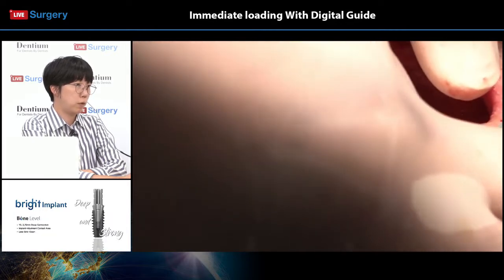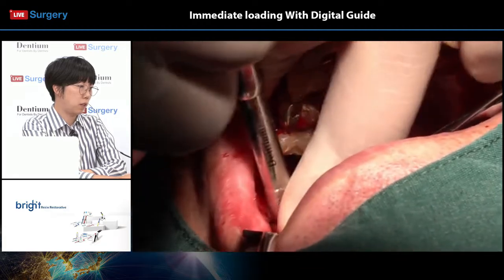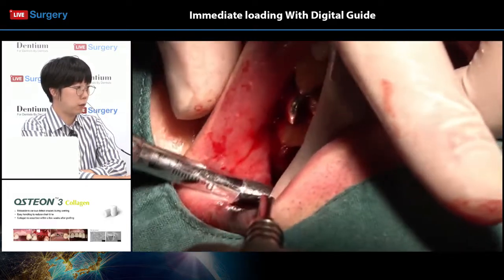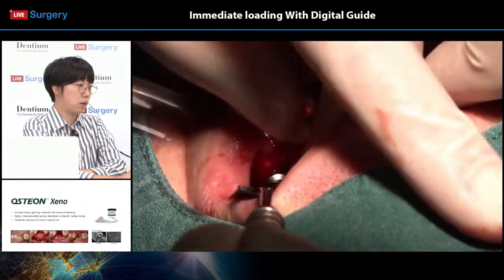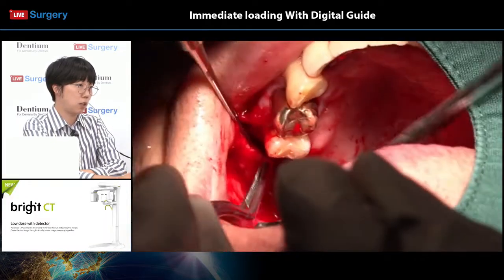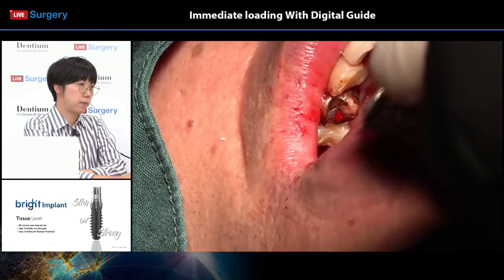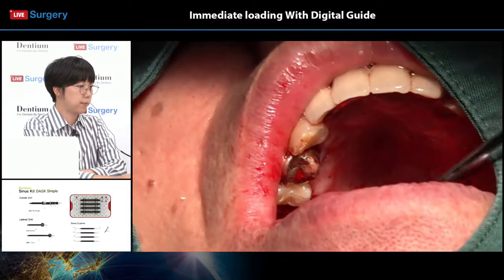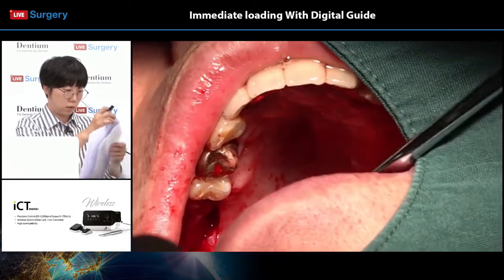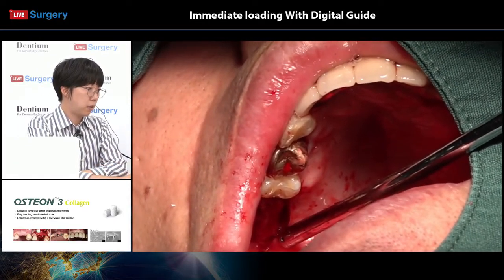Oh, and as I've mentioned before, since Dr. Lee wants to preserve or make keratinized tissue on the buccal side of the implant, a slightly deviated incision line to the palatal side is usually preferred. And since it's much easier to reflect a buccal flap rather than the thick palatal side, in most upper posterior cases, a deviated incision line, such as this case, is usually used. There is still some amount of bleeding.